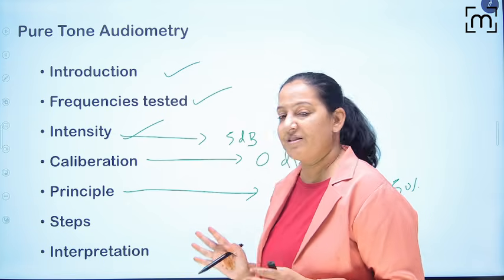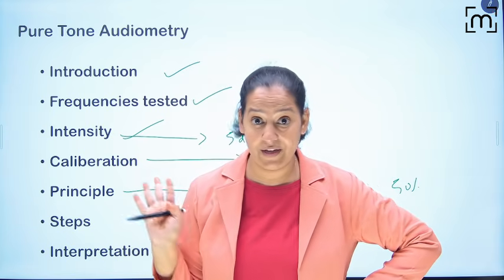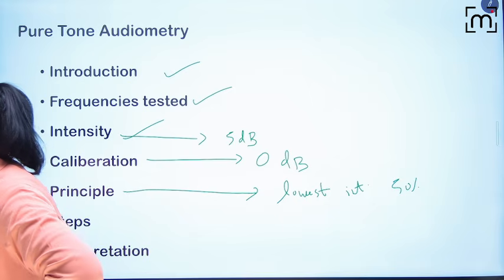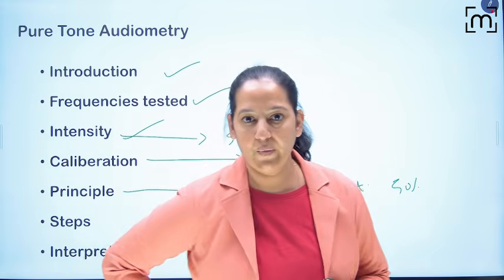These tests are small, but they are complicated. But if you got the basics in the tuning fork, here you are getting it. So, pure tone audiometry. How many of you got it, people? Everyone got it? Pure tone audiometry. Exactly what we are doing here.